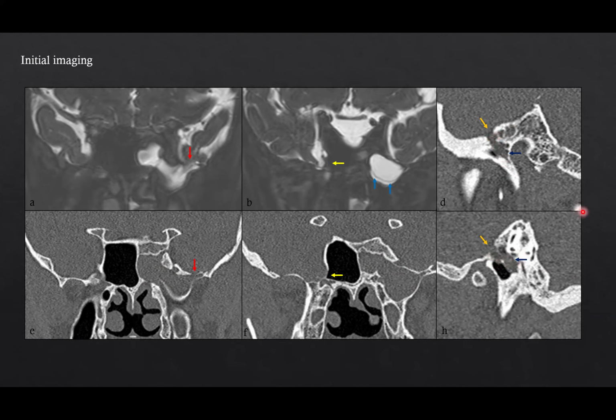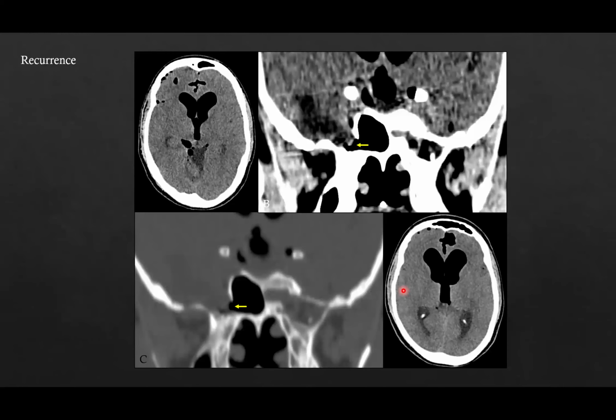at that site. So because the CSF leak was from this meningocele, he was taken up for transnasal repair of this CSF leak. Transnasally, the leak was identified, and the defect was sealed off and repaired. Now, he presented to us after a few months with altered sensorium. Imaging done now showed that he had pneumocephalus, with air in the subarachnoid space and also air in the ventricles.